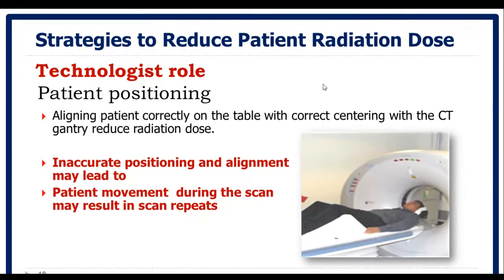In daily practice, if the patient fully extends his legs, in most of the procedures the patient is lying supine. So when everyone is lying supine, there will be a gap here in the waist area.